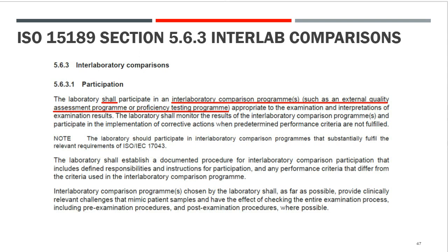Interlab comparisons. This is back to thinking a little more broadly than just inside the analyzer box, more broadly across the lab. And the laboratory shall, non-optional, participate in an interlaboratory comparison program. External quality assessment, as it's called some places, proficiency testing program, as it's called other places. There are a lot of other sections of 15189 that describe the larger, broader laboratory quality management system, quality process, and we need to be aware of what those are.